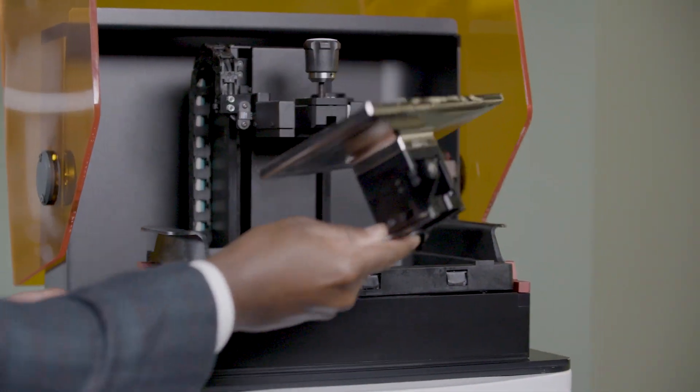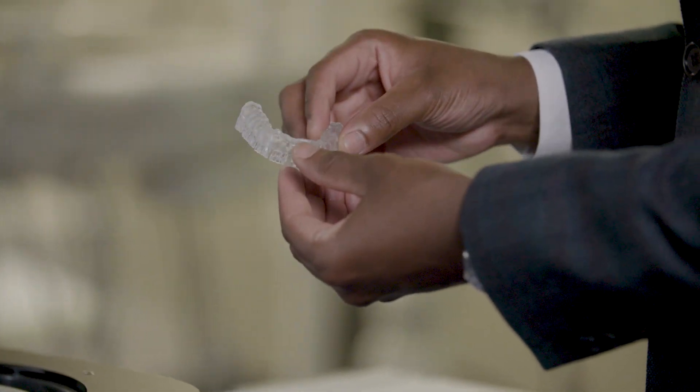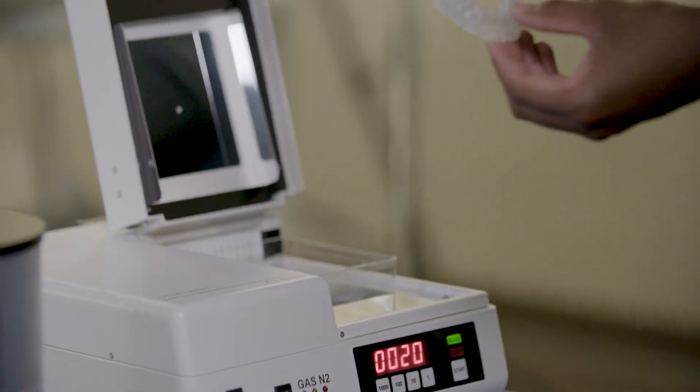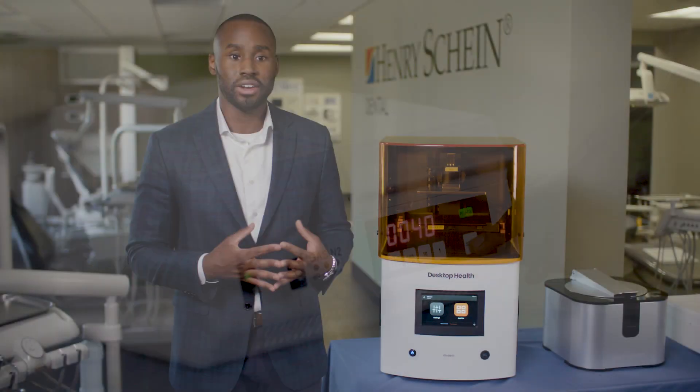Once your appliance is 3D printed, you're going to follow the same wash, dry, and final cure protocol as any other 3D printed appliance. That is washing with 91% or higher isopropyl alcohol. The same machine that does your wash is also going to do your dry, and then putting it into a cure box for the final cure.